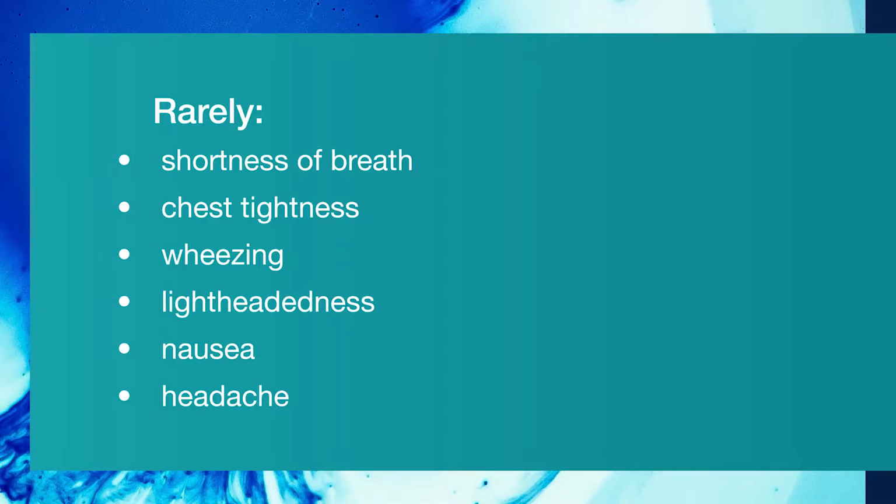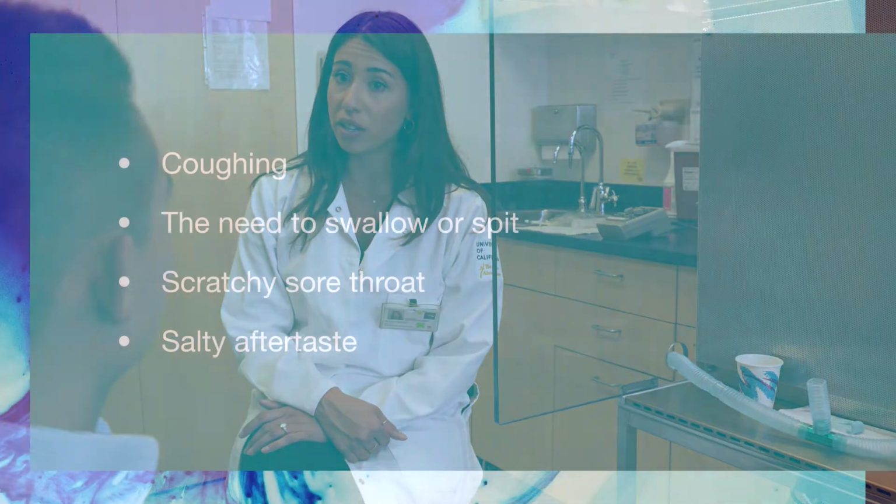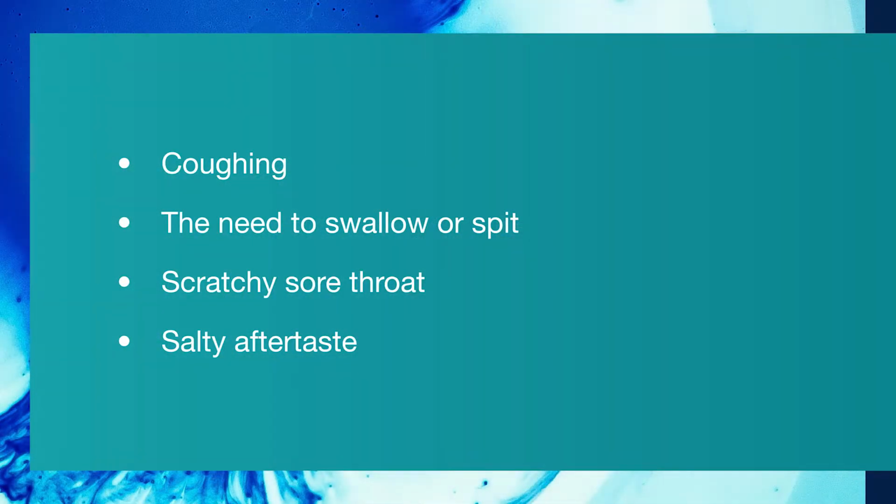Some asthmatics may experience mild bronchoconstriction, wheezing, chest tightness, or shortness of breath, but these are rare, and we've primed your lungs with albuterol prior to the induction to help decrease the likelihood of developing these symptoms. If you do feel symptomatic, however, or are having trouble breathing at any point during the procedure, please let me know. Some sensations that you may experience during the procedure include coughing, feeling like a need to swallow, a scratchy or sore throat, or a salty aftertaste.